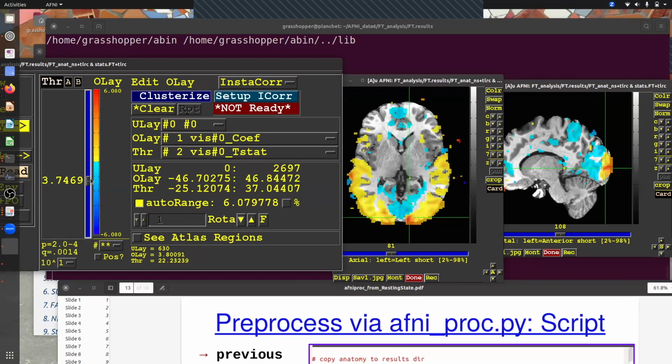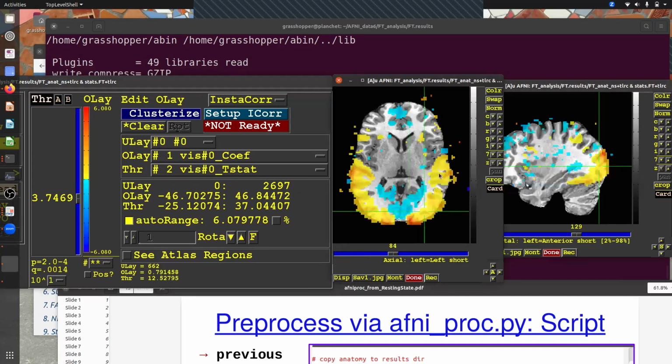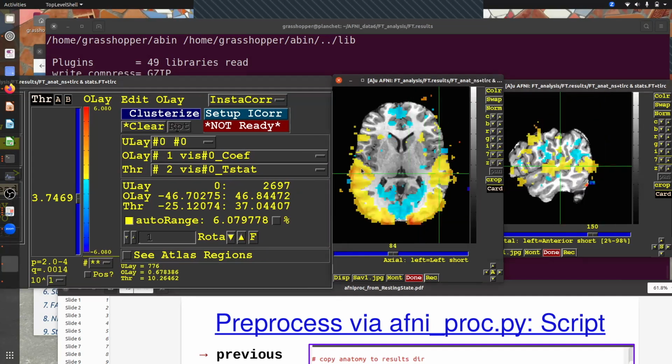Do we want to threshold at, whether you want to think about plus or minus 10% or plus or minus 2% or 2.1%? There are some guidelines or approximate numbers that people like to use, but those are always arbitrary. So something that we do when we're checking our data is we say, not only show me where the statistics are high.